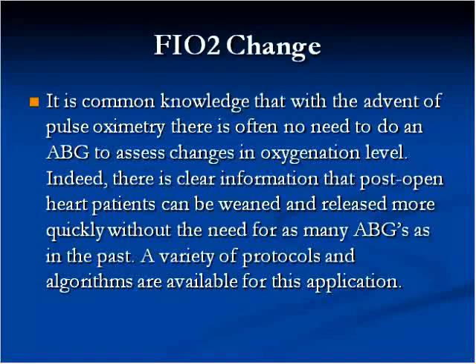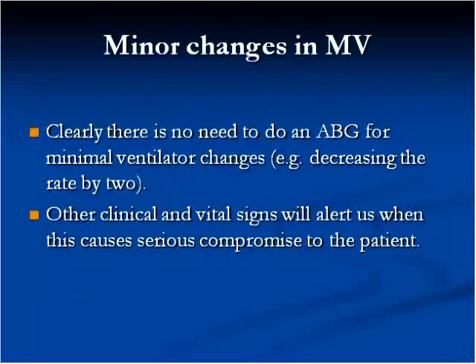And by the way, one of the things you can do if you want information on these other analytes, which is the last thing I think I will discuss briefly, is that after I finish these complications, it really makes sense to batch the blood and run co-oximetry and run electrolytes concurrently and lactate with your sample or creatinine. Again, many of these machines have added new parameters that are available.